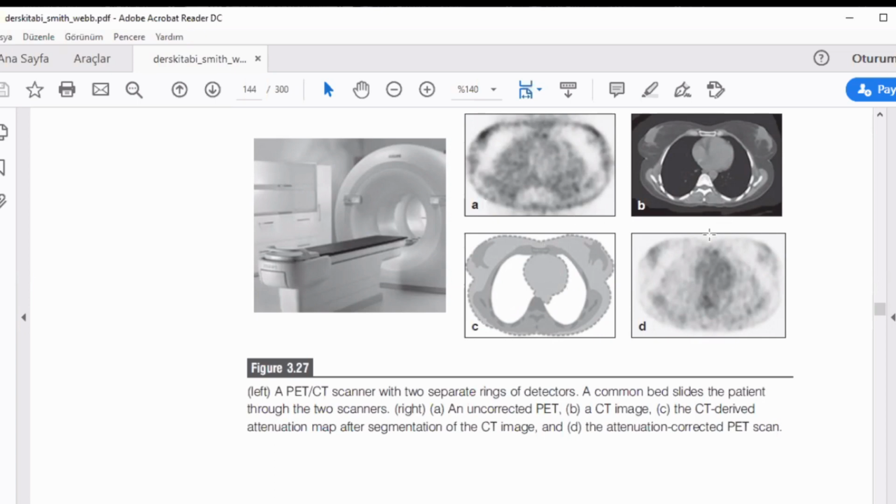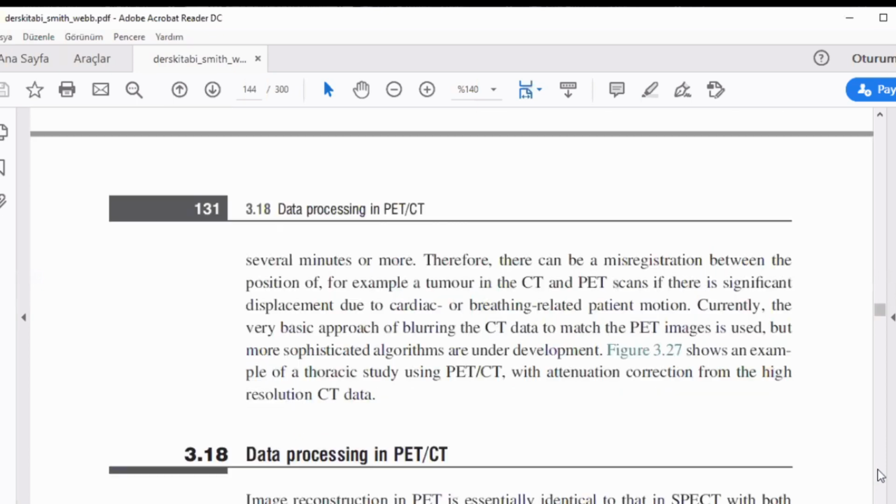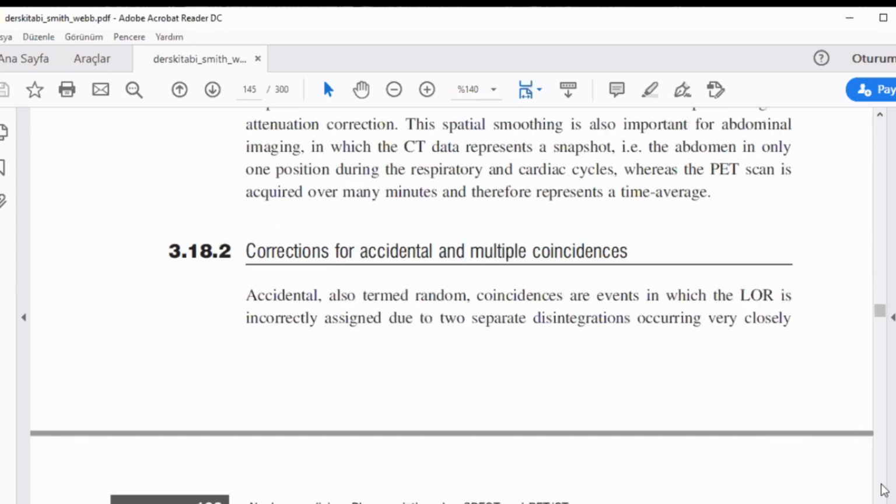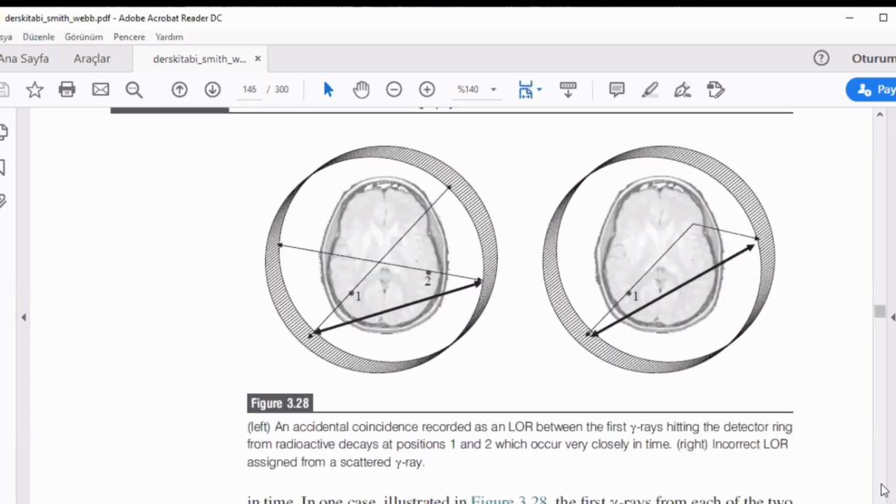Then you combine them, get the boundaries of the organs, etc., and more valuable information can be given to the doctors. Data processing in PET and CT is related to computational science or informatics. Of course, nowadays, all the systems are computer controlled and data are manipulated by utilizing digital approaches.